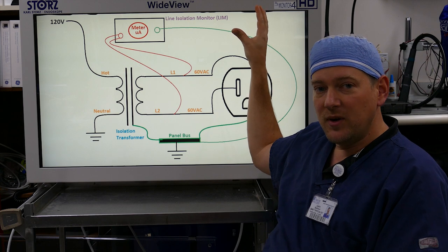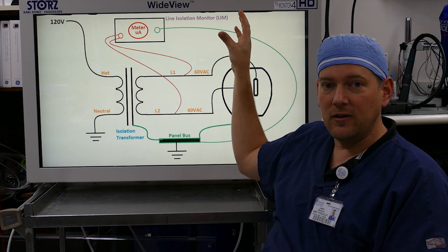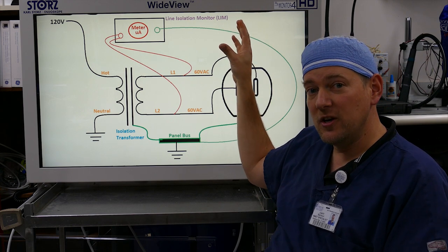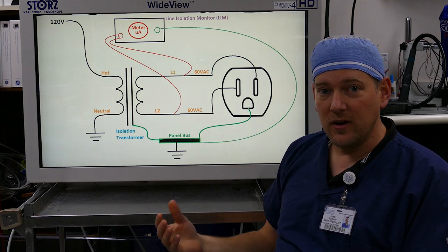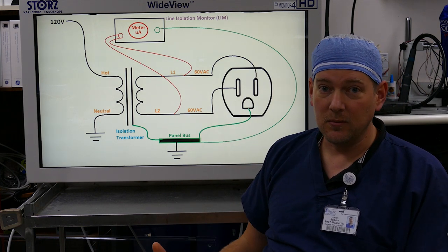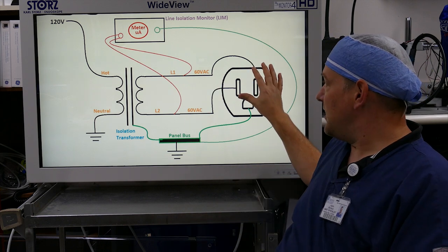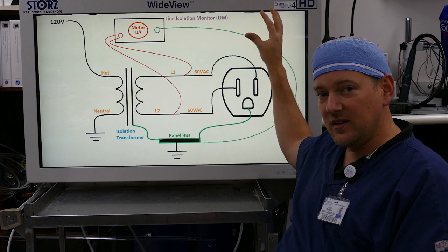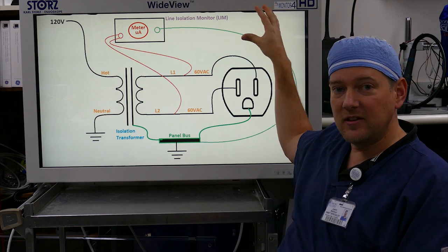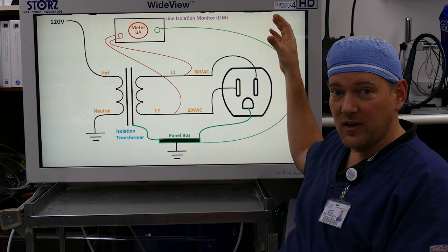Now this is pretty similar to a GFI that you find at your house, except a GFI will disconnect the circuit and of course there's no way you want a circuit disconnected in an operating room. So all this will do is there's going to be a buzzer on the alarm with a flashing light. It'll buzz inside the operating room allowing the staff to see that there is a potential hazard someplace.